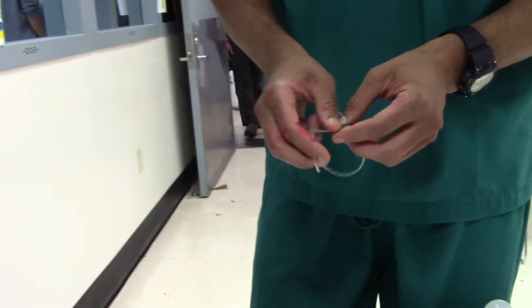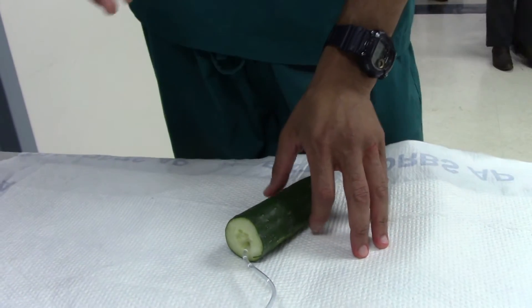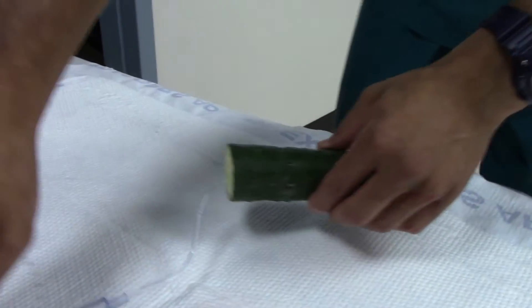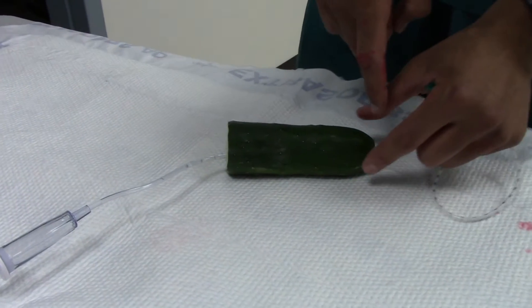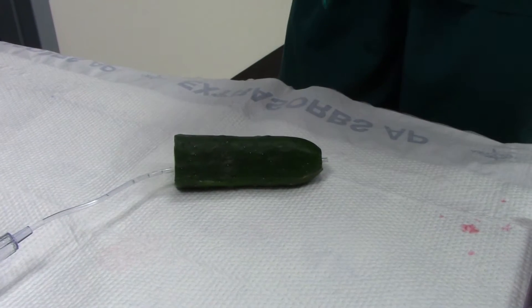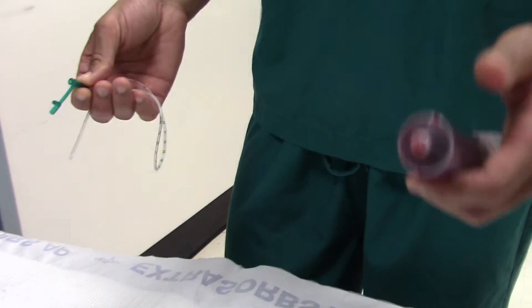To perform a retrograde urethrogram, first put the patient in an oblique position, since you'll be taking an X-ray of their pelvis. Then take the penis and bring it off to the side so that once the X-ray is shot, you get the entirety of the urethra — that's the point, in order to check the integrity.